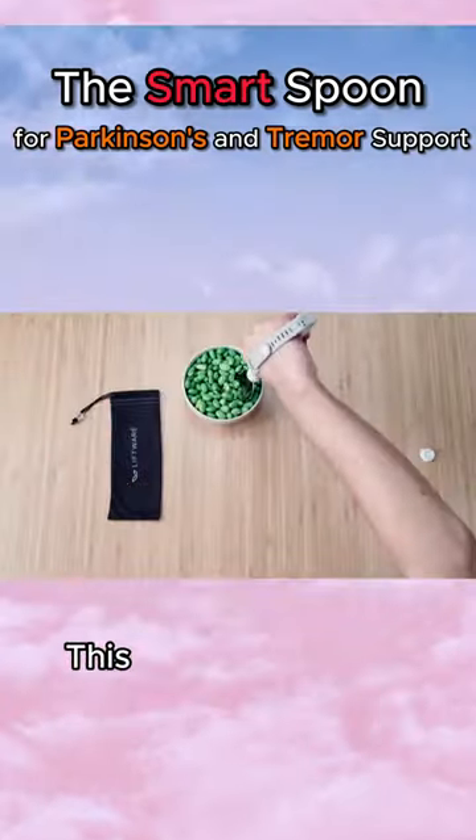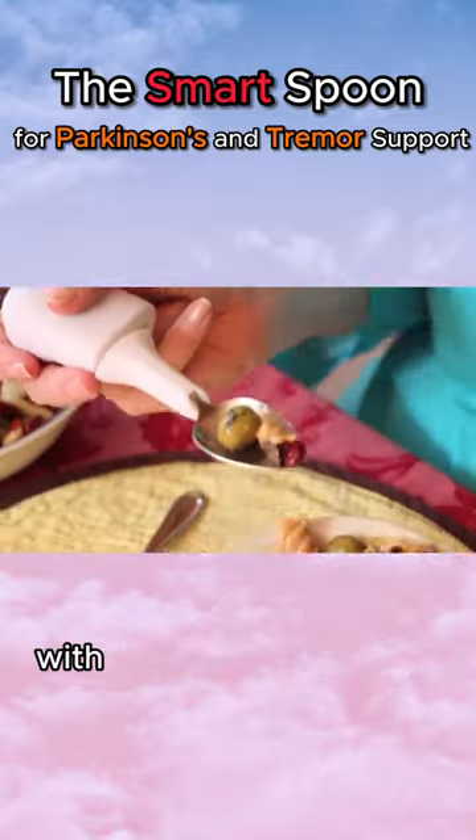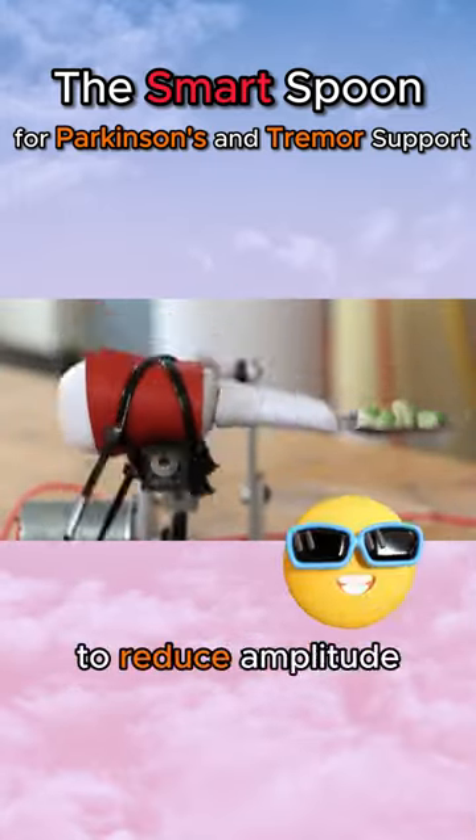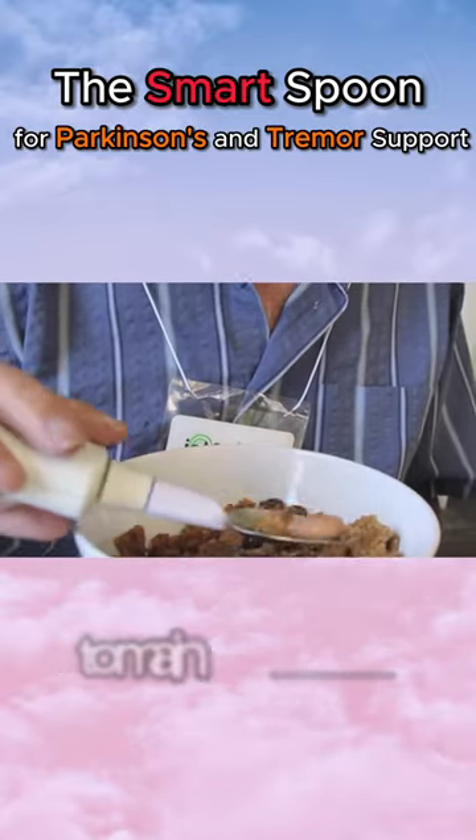Have you ever seen this anti-shake spoon? This intelligent utensil is called Liftware, produced by Google for individuals with Parkinson's disease. It operates by using the counter-movement of a motor to reduce amplitude, effectively sensing hand tremors and providing instant adjustments to maintain balance.